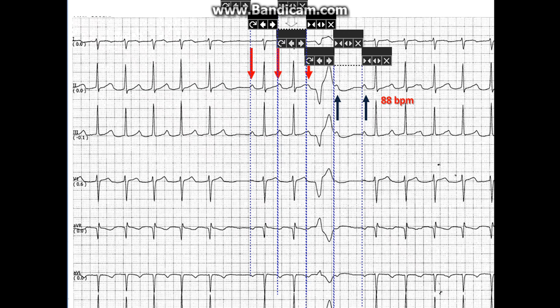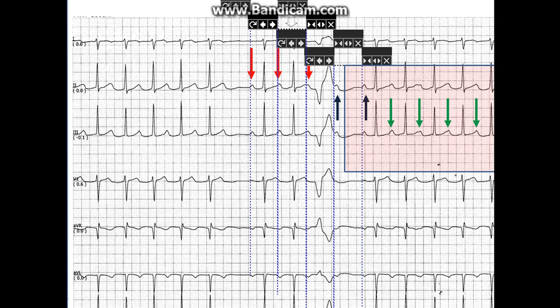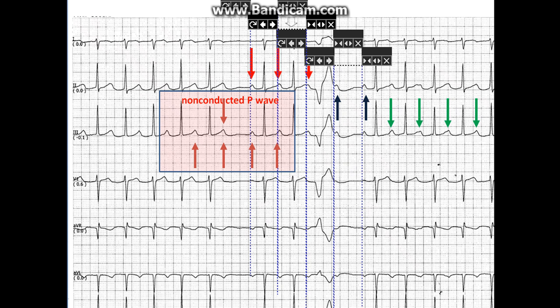Close inspection of the T waves — like in lead 3 — will show that the T waves vary. This is because a P wave is merging with the T waves. Now there is a concern because there is an unconducted P wave, marked with a double brown arrow.